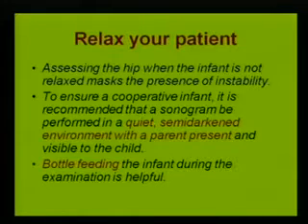You cannot imagine making a maneuver with a baby forcing his legs. You cannot take anything from him. So relaxing the patient and finishing the examination as early as possible, from 7 to 10 minutes, is crucial.